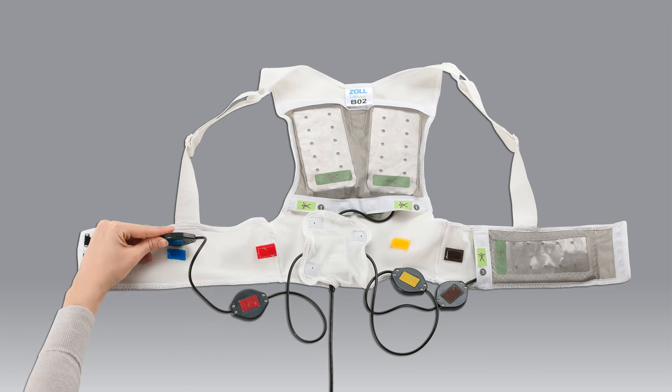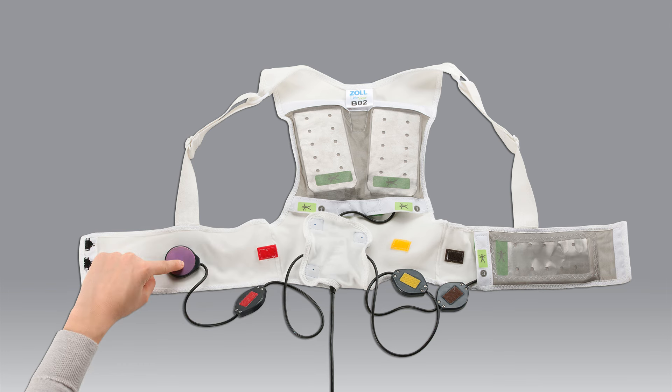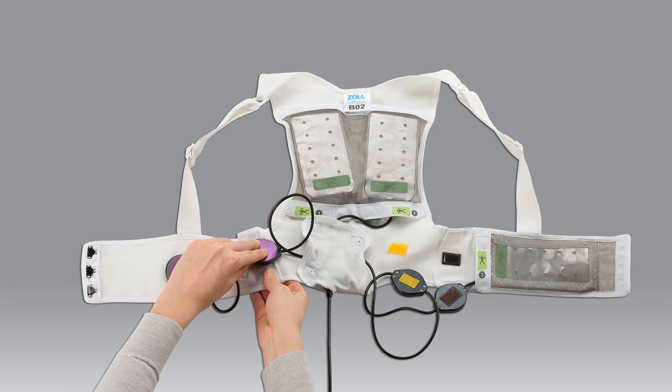The final step in putting together the electrode belt and the garment is to attach the electrodes. To do this, match the colors on the back of each electrode to the colors of the Velcro on the garment.